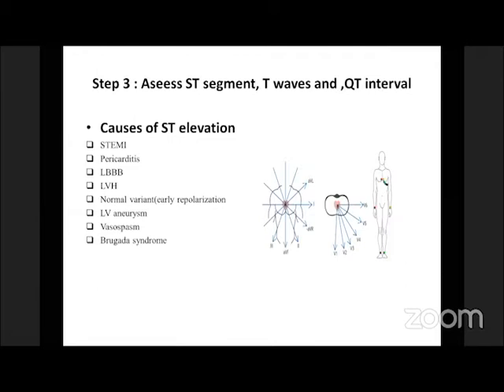Frequently, we may face an ECG with ST segment elevation, but we have several causes of ST segment elevation. Not every ST segment elevation is myocardial infarction.